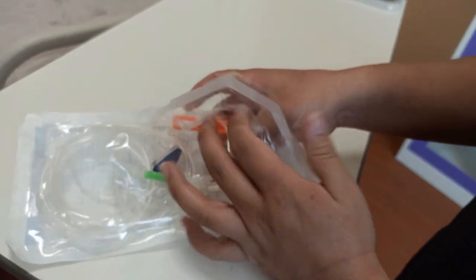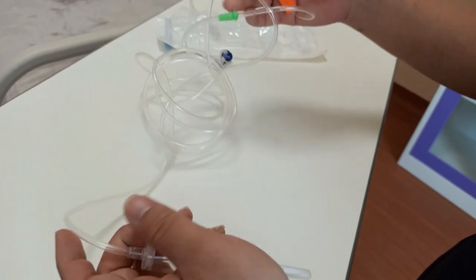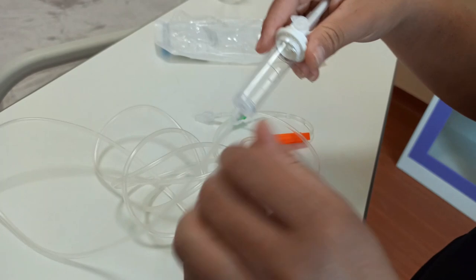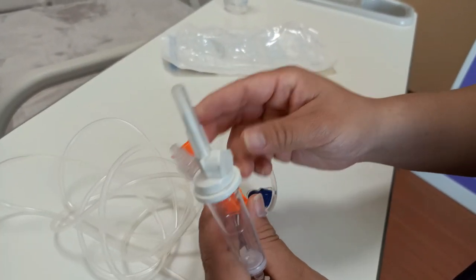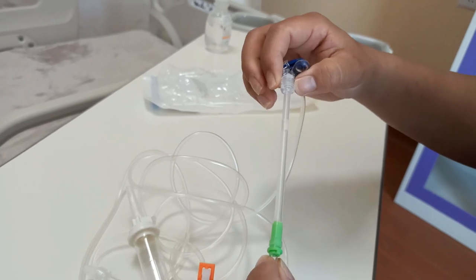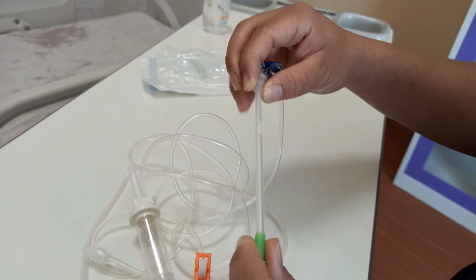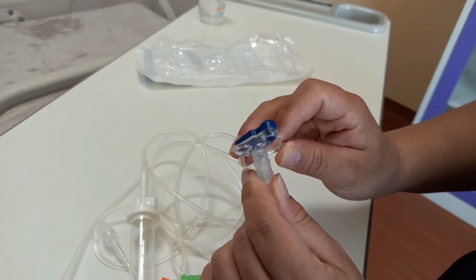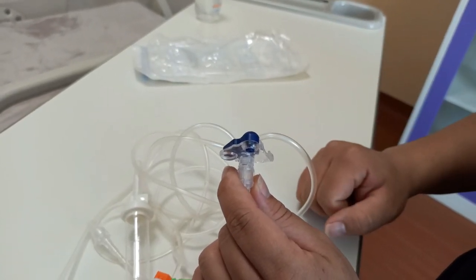We'll open up the packaging and remove the infusion set. Like any normal IV set you can see the common components such as the roller clamp. What is different from other infusion sets is a stretchable section, and also a protruding part from the infusion set which is going to be the key element for fitting into the infusion pump.